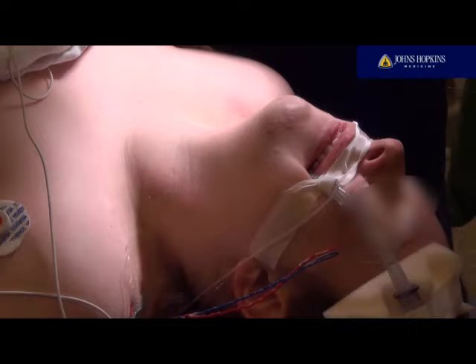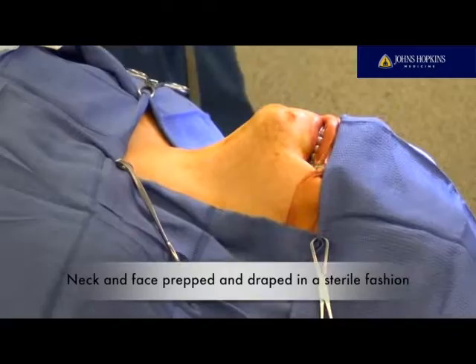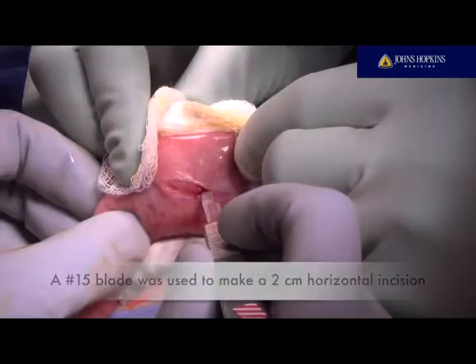Here we have the patient on the operative table with the neck gently extended and a shoulder roll underneath the shoulders. The lower lip is infiltrated with 1% lidocaine with 1:200,000 part epinephrine. The lower part of the face and neck are prepped and draped in a sterile fashion. The mouth is cleansed with Hibiclens and water. The lower lip incision is marked with a 15 blade and a tooth guard is used to protect the lower dentition.